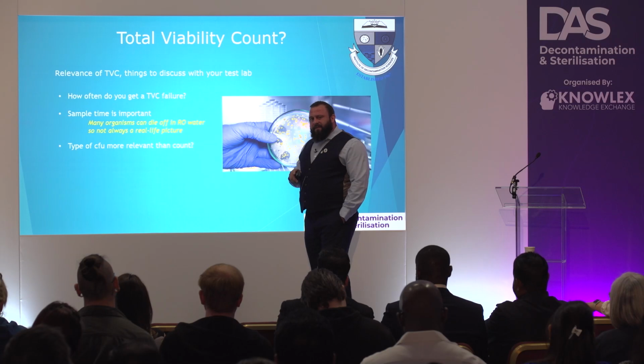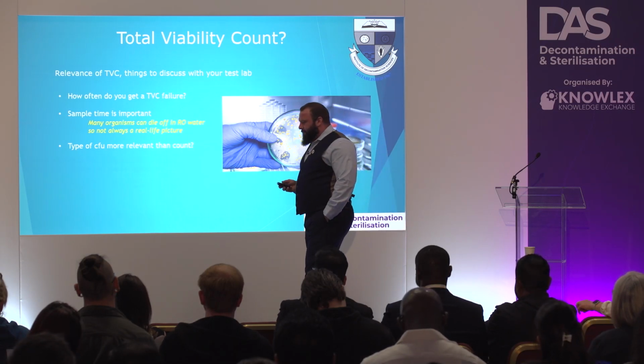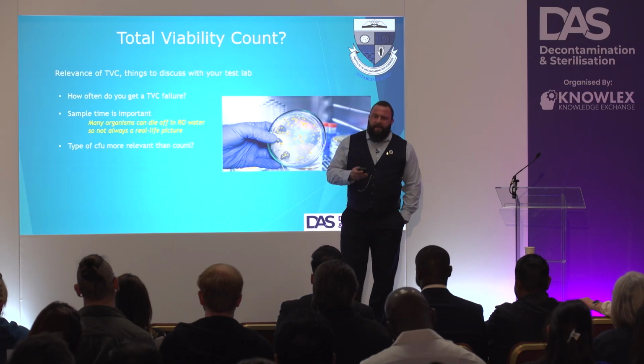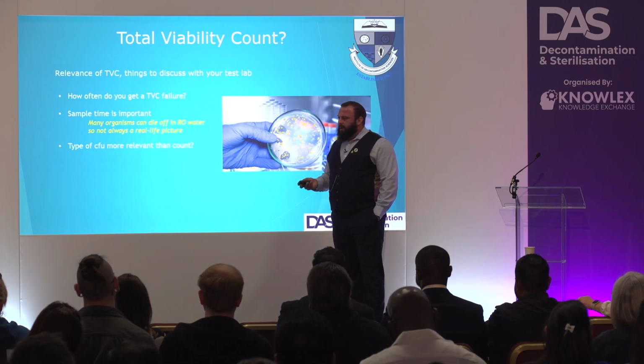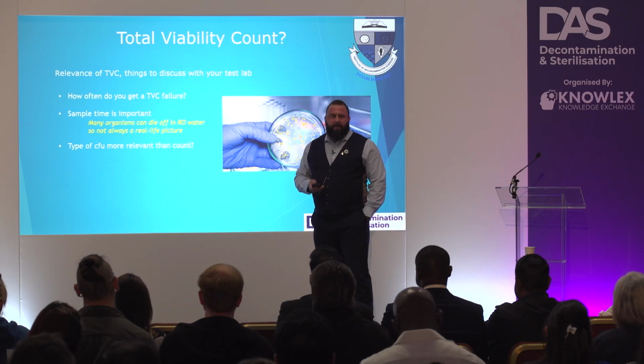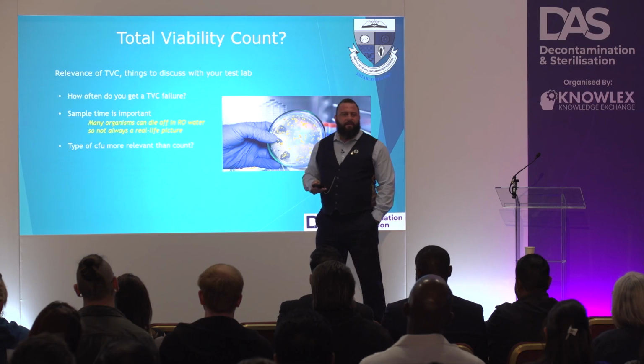And we're actually finding we're taking action and restricting the use of the washers and the water system based on scores lower than 10, because we've got pathogens in the water. This is what a lot of people are not looking at. We get a score, we get 10, we don't know what it is, but as long as it's below 10, we carry on using scopes.